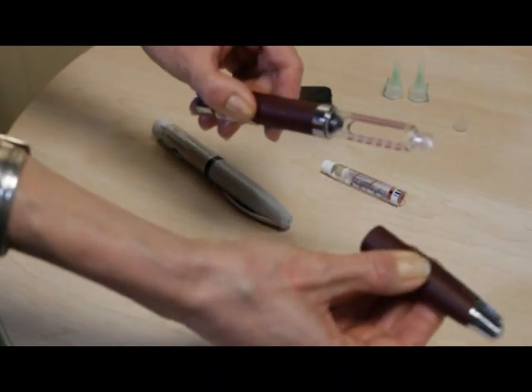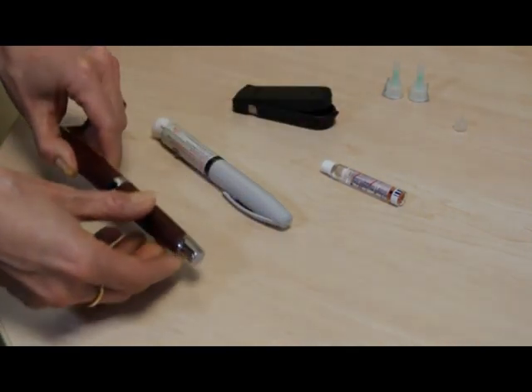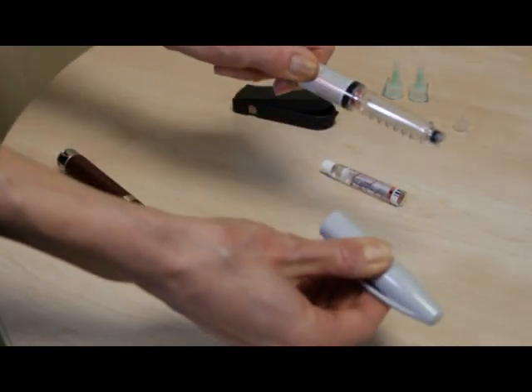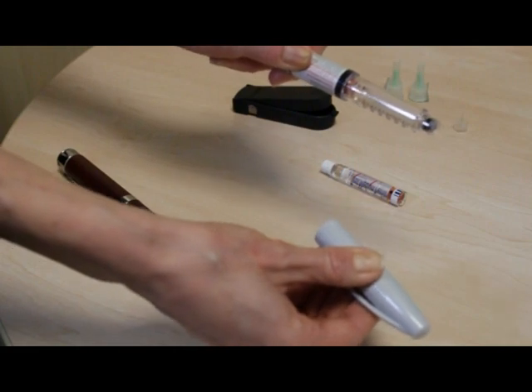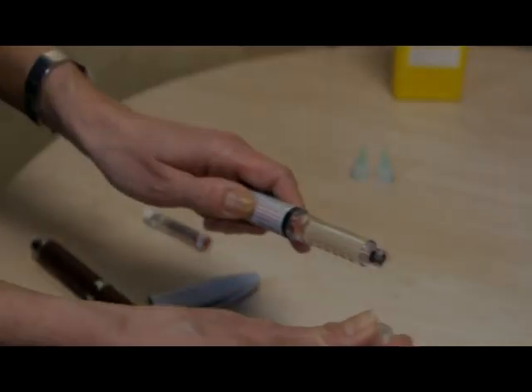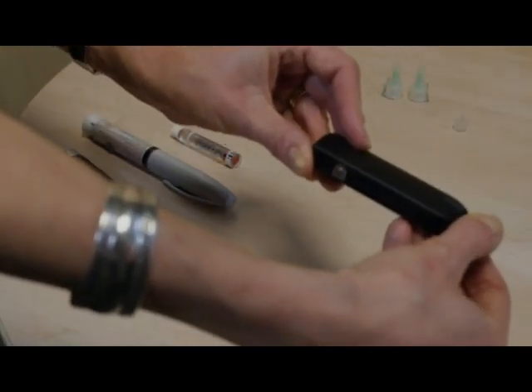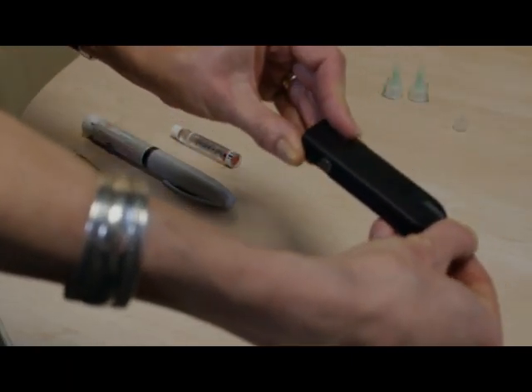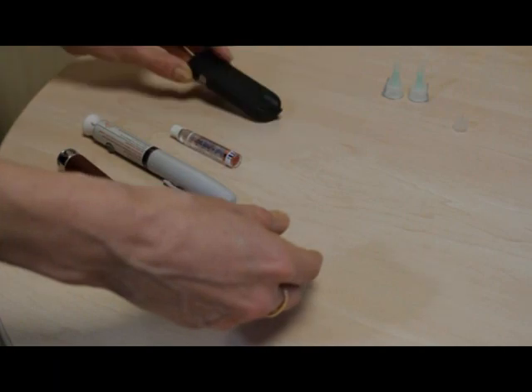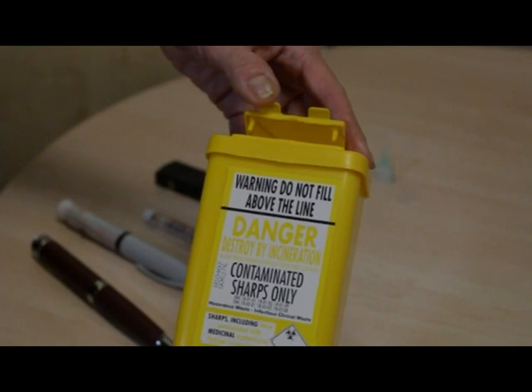A typical injecting kit consists of an insulin pen, which might be a reusable one or a disposable one. In a disposable pen, the insulin comes as an integral part of it. In a reusable pen, you'll need to fit an insulin cartridge separately. There will also be a needle that fits on to the end of the pen. It's really important that you dispose of all the sharps very safely. You can either use a needle clipper which clips off the sharp point of the needle and stores it safely inside, or there's also a sharps bin where you can throw the entire needle away.